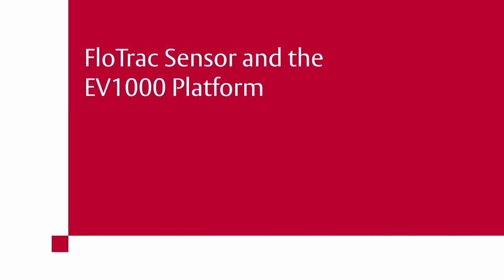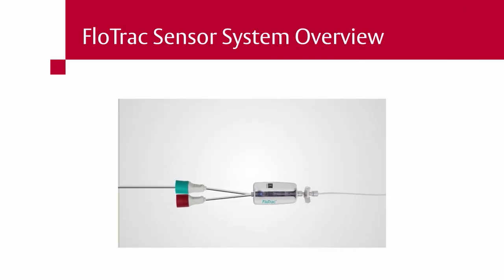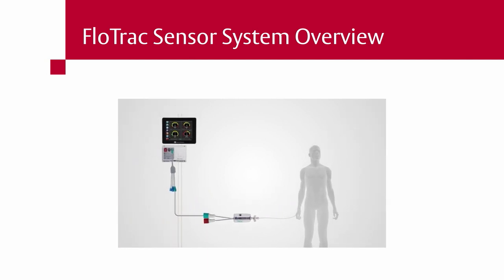FlowTrack Sensor and the EV-1000 Platform. Proper setup of the FlowTrack Sensor for use with the EV-1000 Clinical Platform requires the following components.